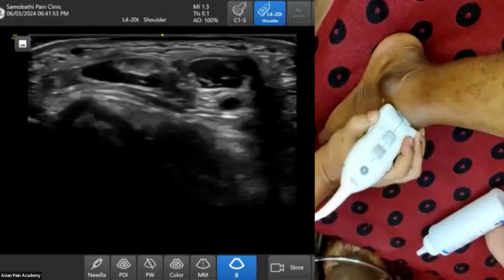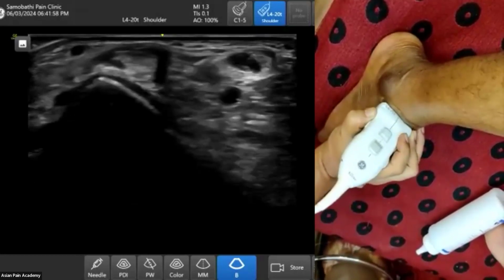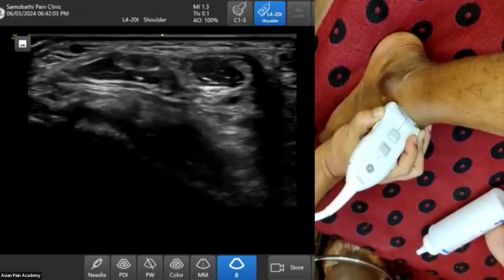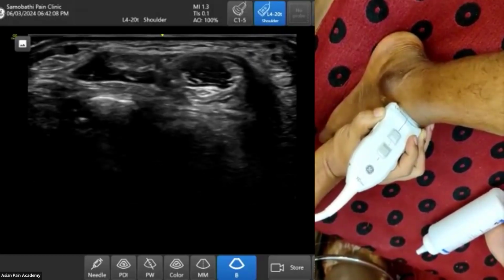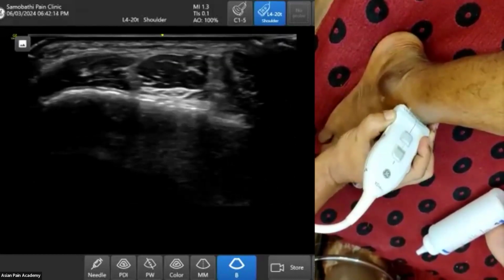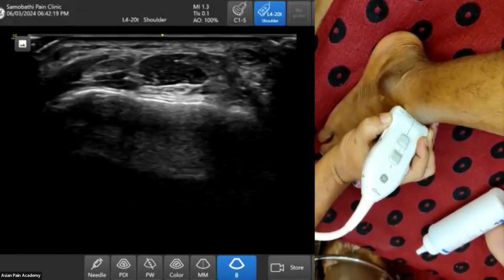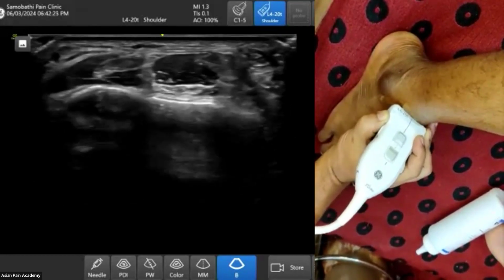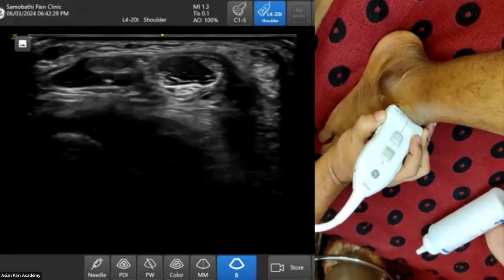Here you remember, we will search these nerves above the talus bone. This bone is talus. But if we go up, then in this area, see, there is no bony contour, there is nothing. If I go up, then it is the tibia. In the tibia area, you will not see any cartilage mark. How will you know that from tibia to talus has come? There is no cartilage above the white periosteum. As soon as I go in this area, there is nothing. It is the space.